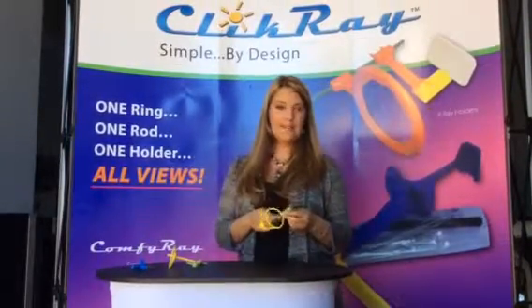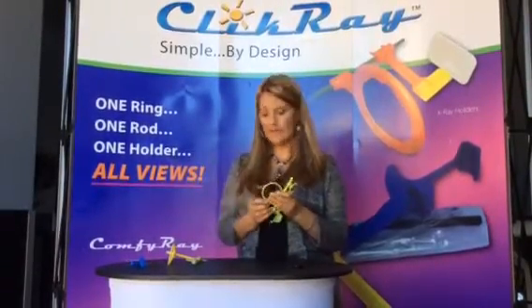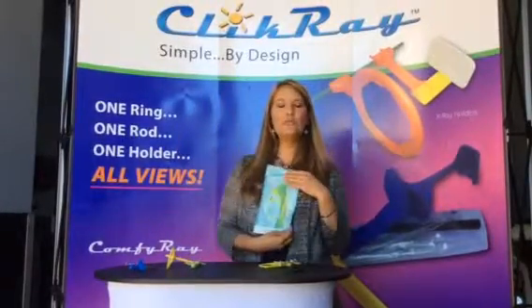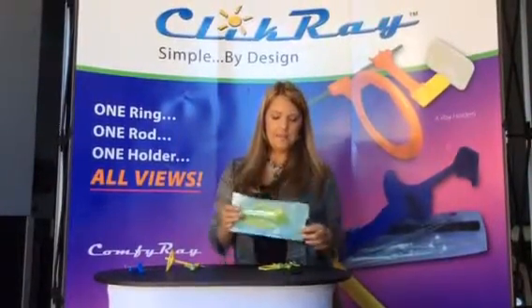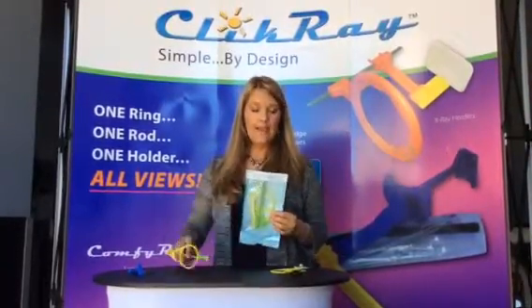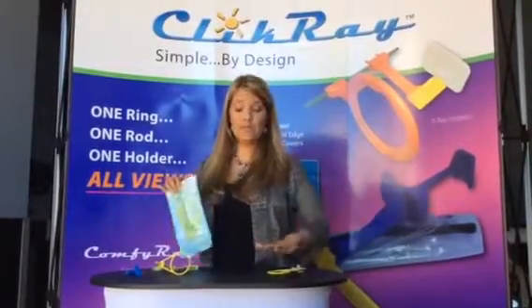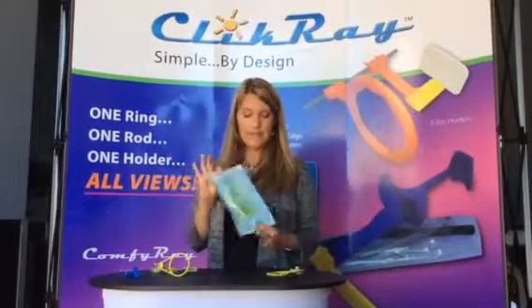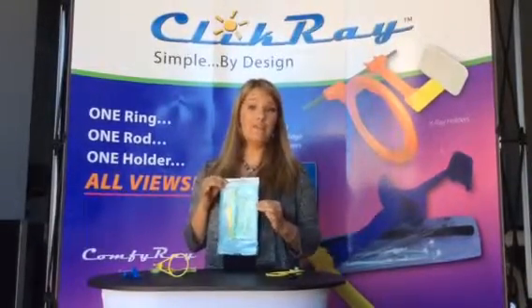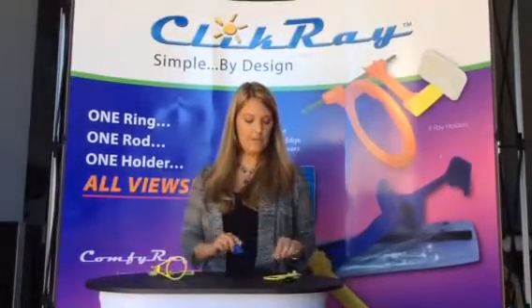When you're done, you take your sensor out, disassemble this, and put all of it into one autoclave bag. This is a big deal because I know a lot of people taking x-rays have to dig through different autoclave bags to find the correct parts and pieces just to set their x-ray table up. This way everything is in one bag and you're going to save a lot of time, energy, effort, and money.